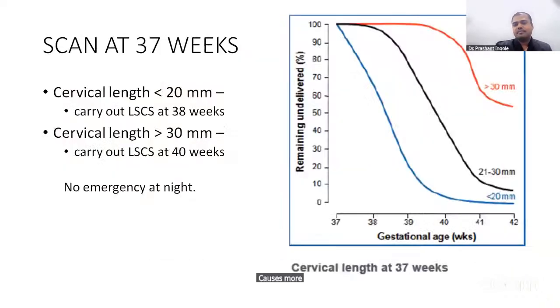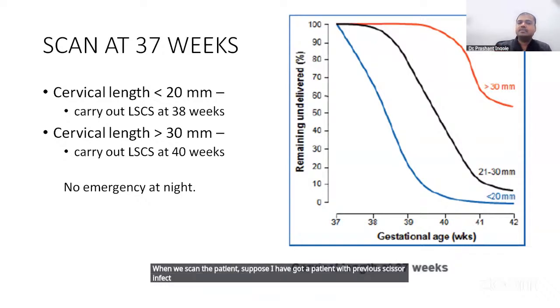Now, in the later part of the pregnancy, when we scan the patient, suppose I have a patient with a previous cesarean section and I want to do an elective section for the patient.